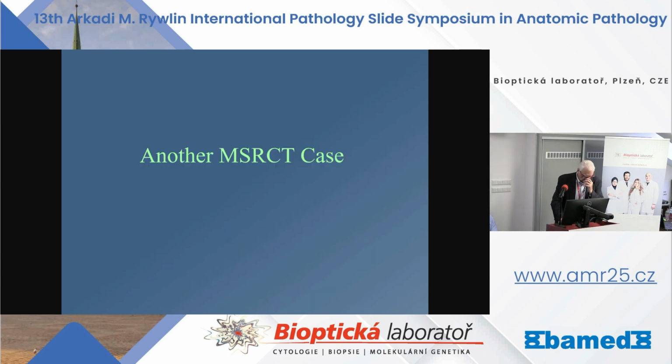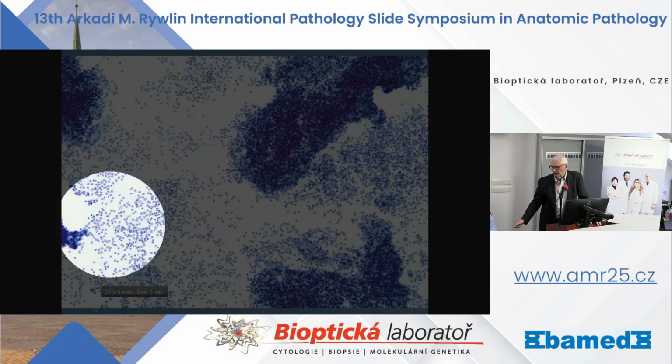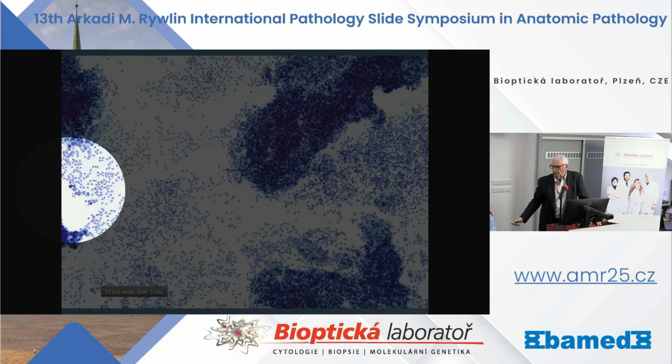Let me show you another malignant small rounded cell tumor case. This case was only about 3 or 4 years ago. A 25-year-old man from Mexico presented with a 5-centimeter mass on the instep of his foot. And I did the aspirate. Notice here, highly cellular. Again, 3-dimensional thick clusters, as you notice over here in the upper right. Single cell population. So you really can't tell, it really doesn't help you.